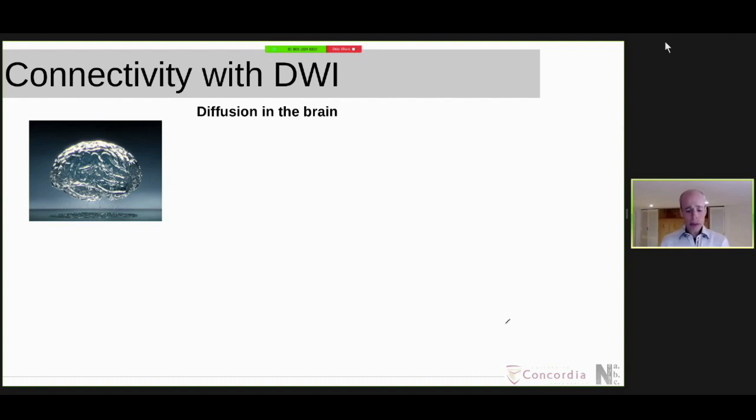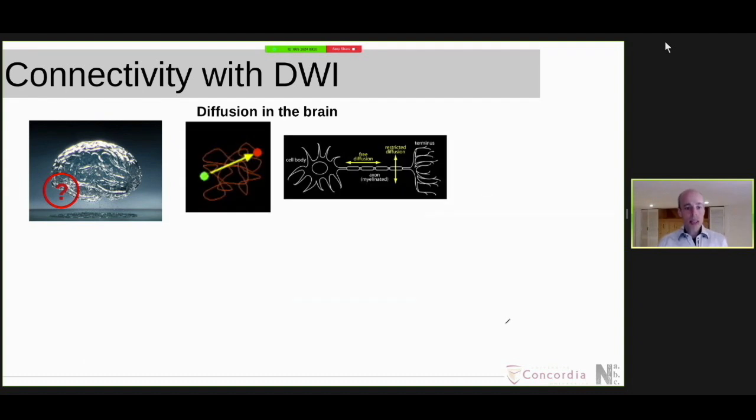We know that the brain is primarily made up of water, and we exploit the fact that the brain is made up of water to do diffusion imaging. And this image that I'm showing you here is obviously a big, beautiful brain. The only problem being it's missing 50% of its neurons. So the cerebellum is missing from this and many other brain images and brain imaging studies across the last 30, 40 years. Okay, so we exploit this idea of the brain made up primarily of water.